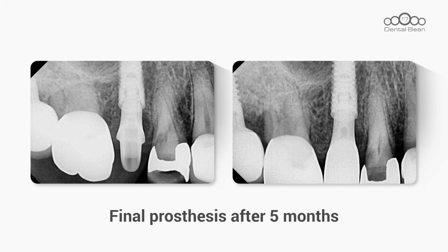If you look at the X-ray on the left, the abutment was not fully connected. If you encounter an X-ray like this, you should carefully reposition the hex and reconnect the abutment properly, so that, as shown in the X-ray on the right, the black line around the 11-degree tapered connection is no longer visible, confirming complete seating before proceeding further.